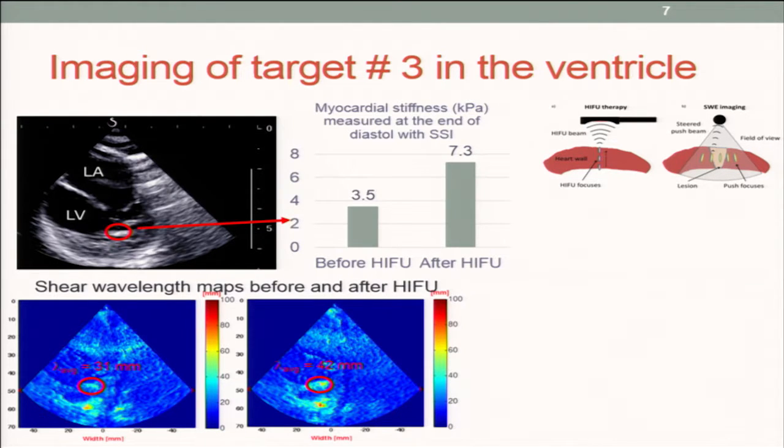We observed stiffening — we doubled the local stiffness where we treated, measured with shear wave elastography. Similarly, as you can see on the passive elastography, the average wavelength was increased by 20% in the same location. So we are not sure the tissue was ablated, but at least something happened.